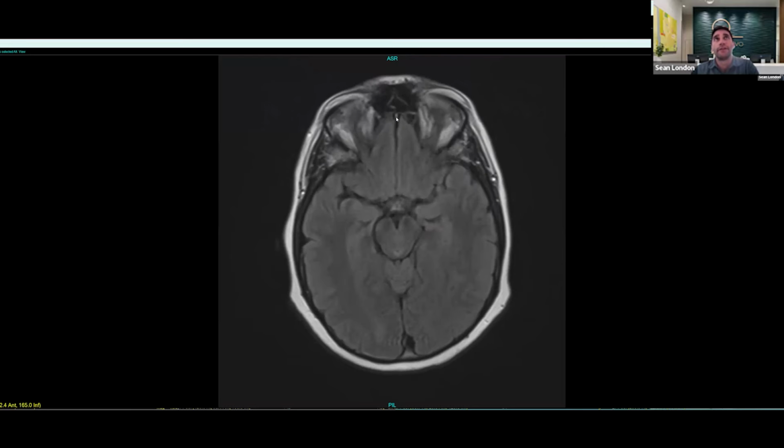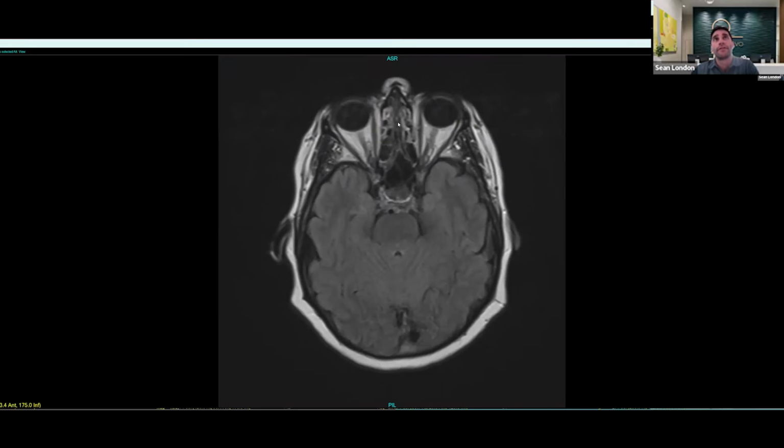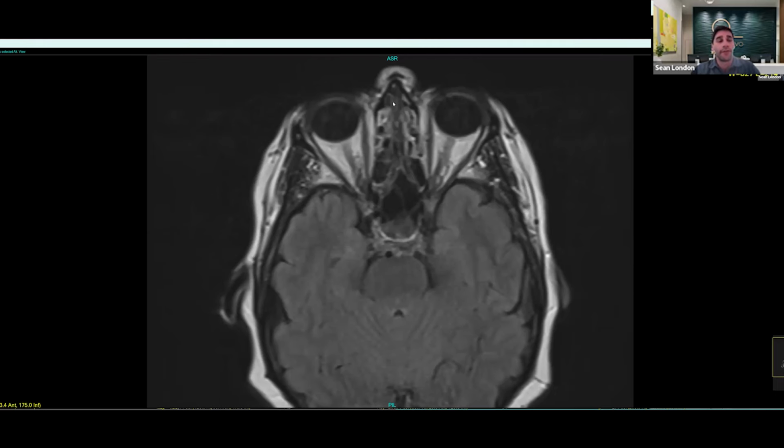Whenever we get inflammation or sinusitis, what we're going to start seeing is tissue thickening along the walls that surrounds the air. And so right here, these are called the ethmoid sinuses. These are between the eyes. You can see this white line starting to get a little bit thick right here, and this is a sign of very mild inflammation of the tissue. This is really common, just being exposed to the environment. Allergies, common head colds can cause this, and it's generally a transient process that doesn't really require any treatment.